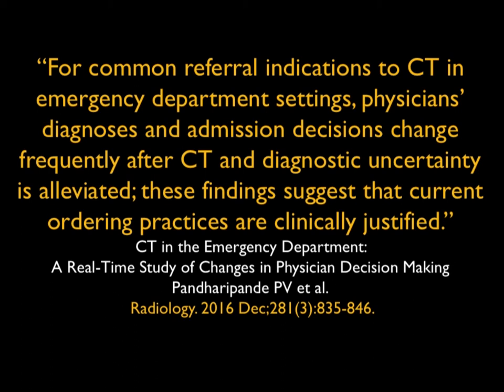Well, the truth is, they're more than justified. It probably means we're not scanning enough patients. We're not having enough normal studies. So I think this push not to do things has had some impact, but you can see when CT is used well by people who are really good at doing it, it just has tremendous, tremendous results.